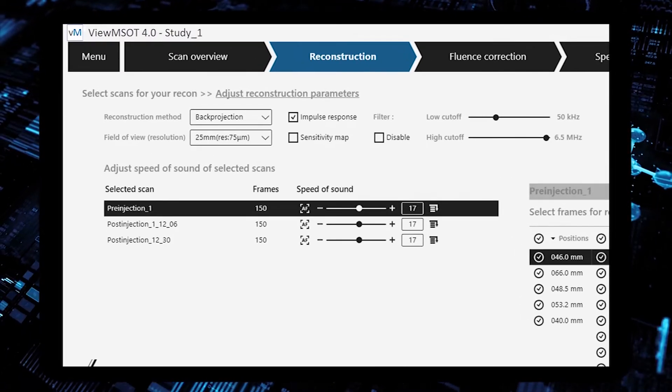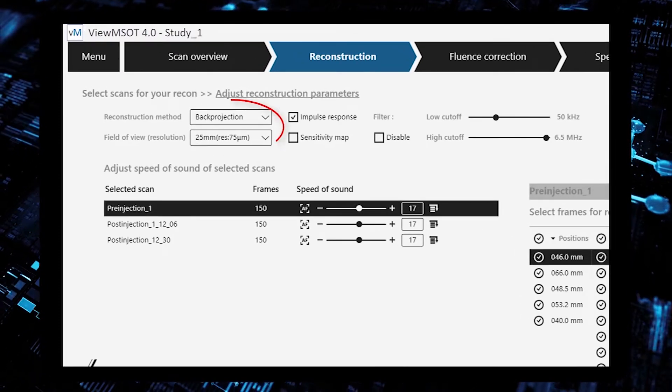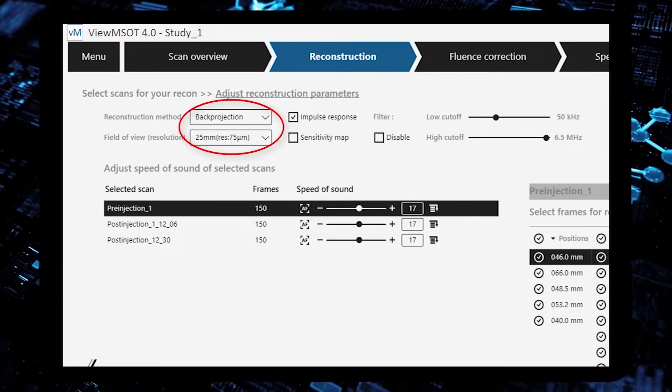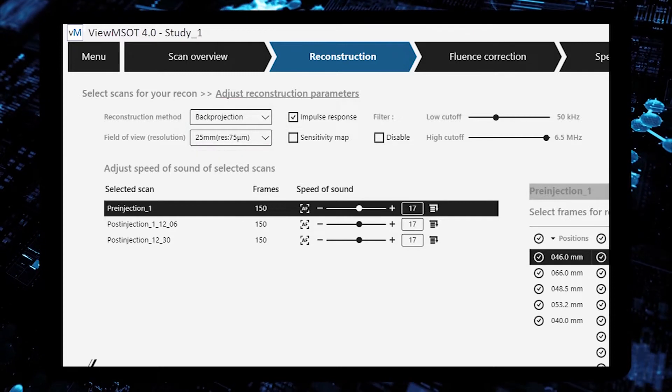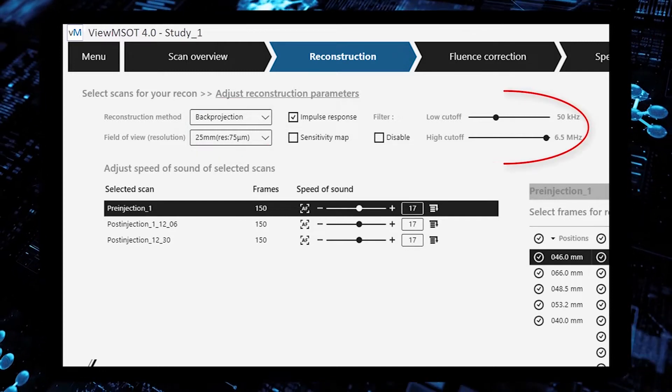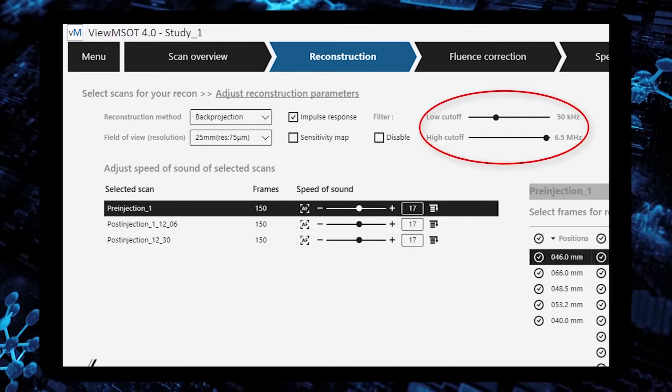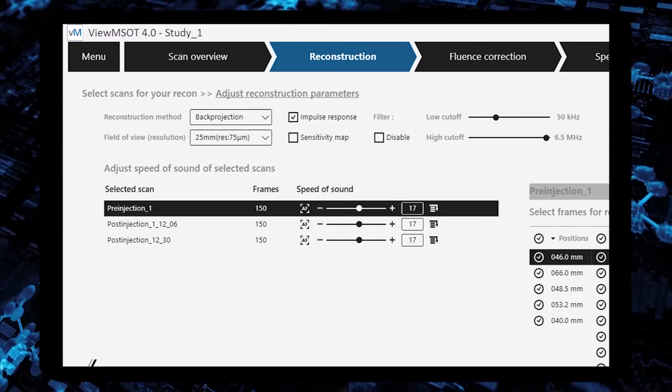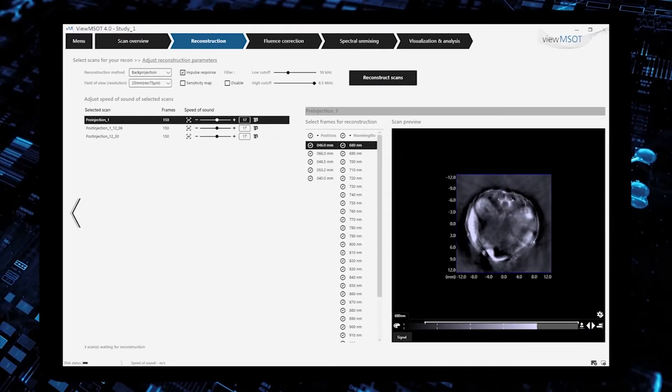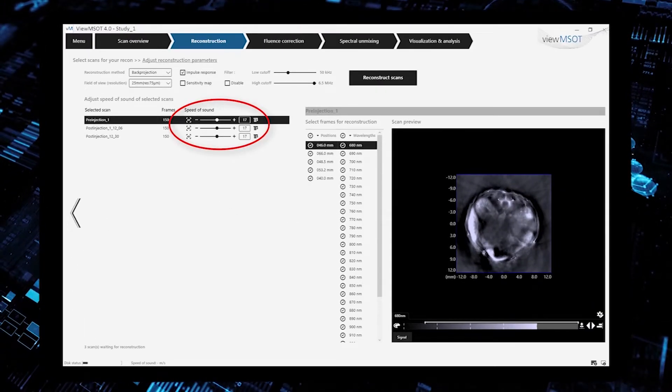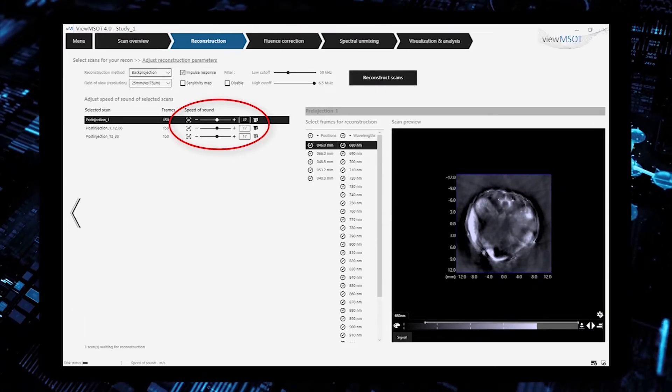Then, you choose the reconstruction method, field of view, bandpass filters, and optimal speed of sound.